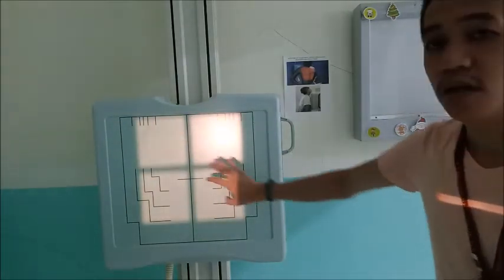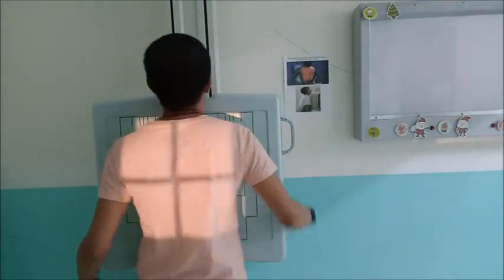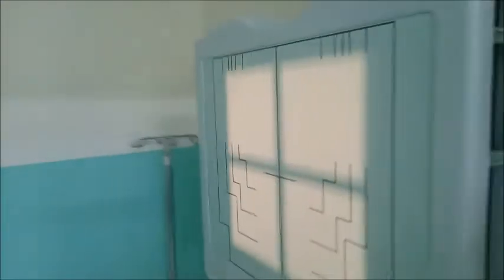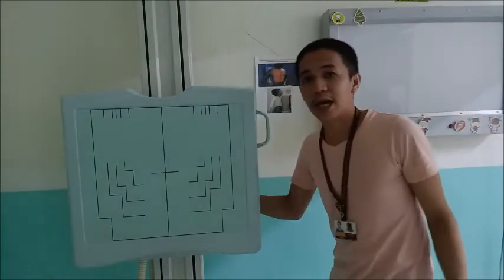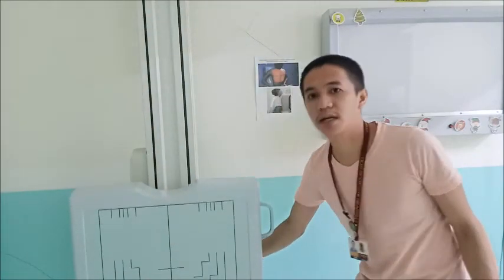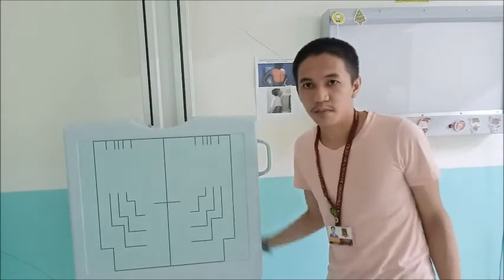Okay. So 14 by 14 collimation for an average view of the patient. And then on the side, we have a button. Every time you work in a new facility, you have to be familiar with all the actions of your machine or the buttons for the movement. Okay, the purpose of this button is for the up and down movement. Whether the patient is tall or short, you can always adjust.